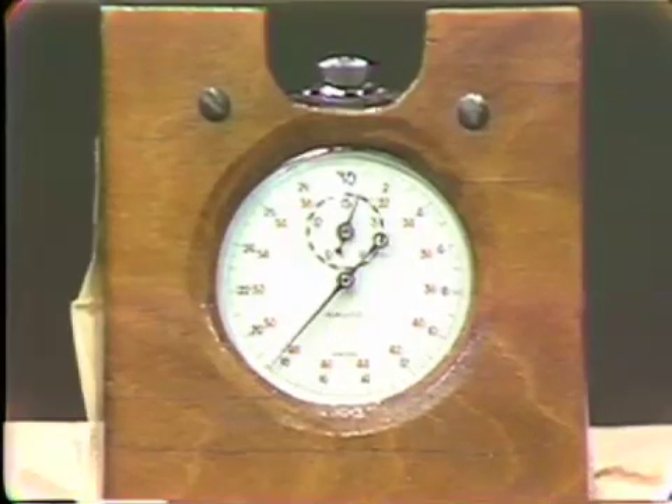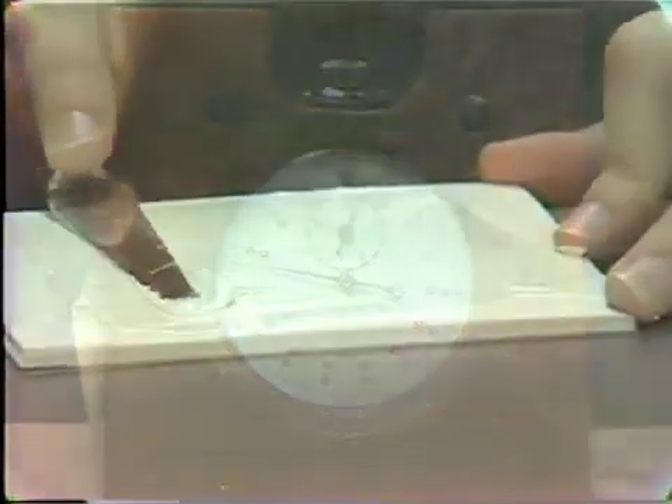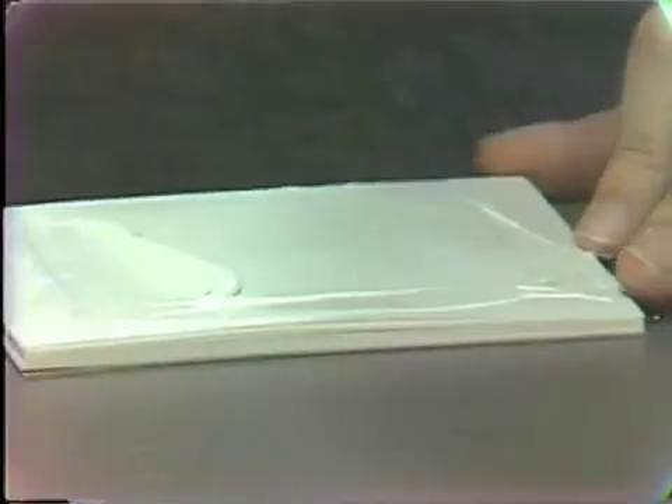Our time is almost up. We collect the material from the mixing pad, and we are now ready to load the syringe.